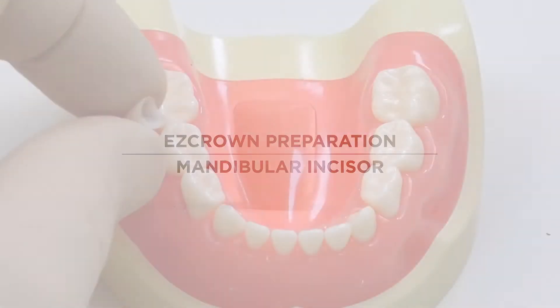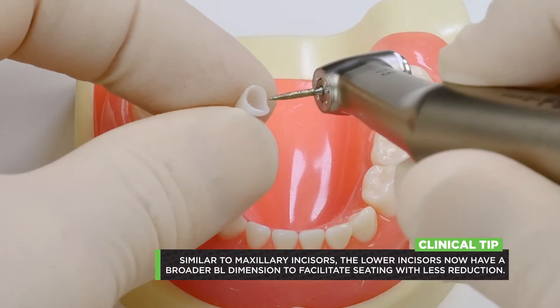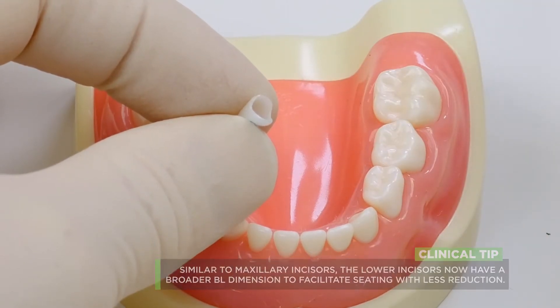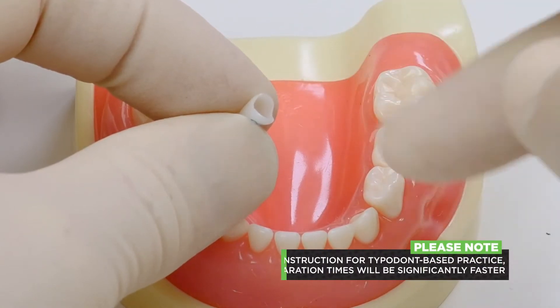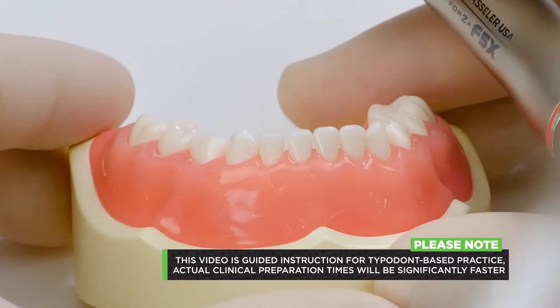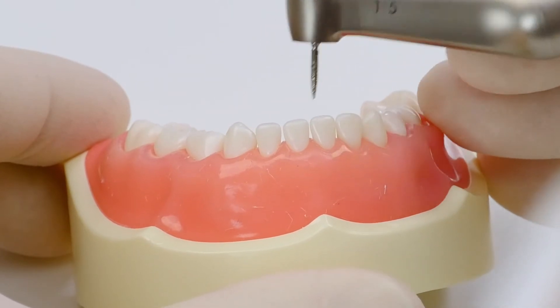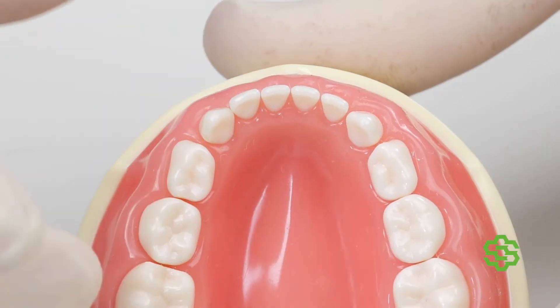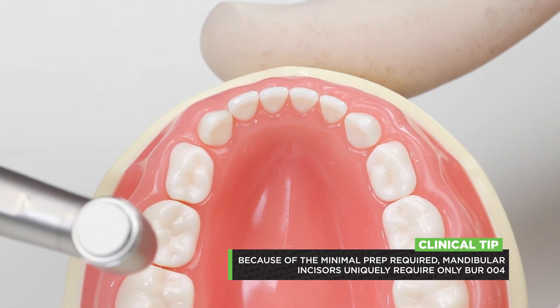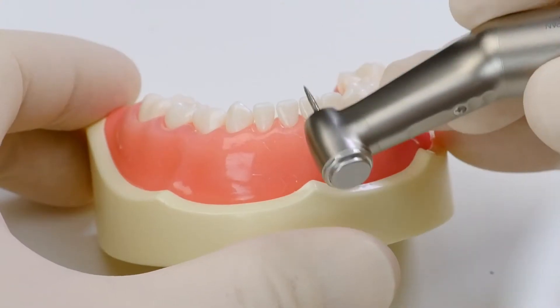We're going to do a lower anterior preparation. Since we've made a design change, I can show you here — we broadened the buccal-lingual dimension of these crowns so they would require less reduction compared to our previous version. They really don't require a lot of reduction at all. Normally with other teeth we use different burrs for depth cutting and subgingival reduction, but because the lower anterior is such a small tooth, I do the whole thing just with the number four burr or the flame diamond.